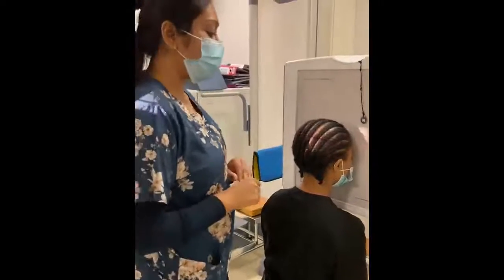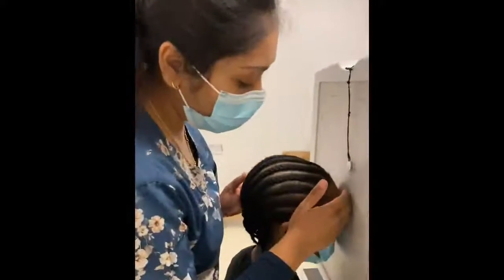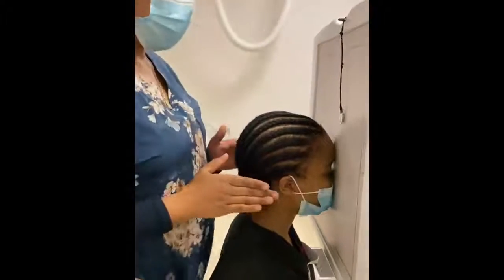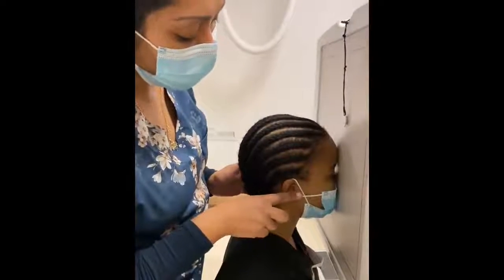So in terms of your patient positioning, basically we need the forehead and the nose to be touching the image receptor. Okay, so that way, and from this position we need to make sure that the OML is now perpendicular.